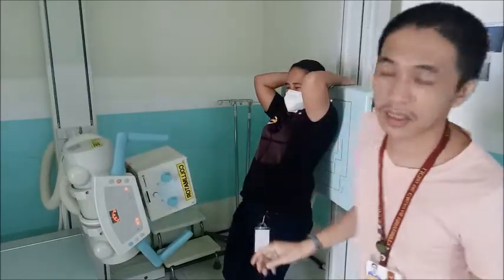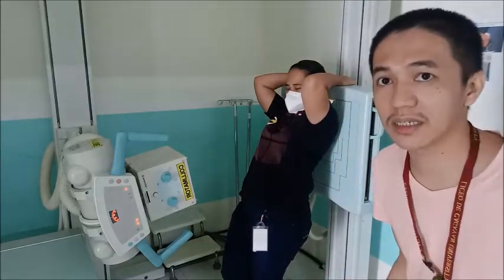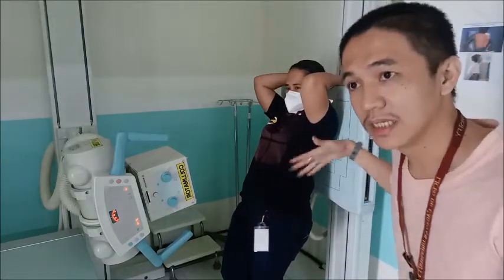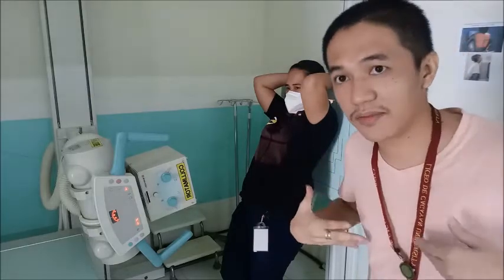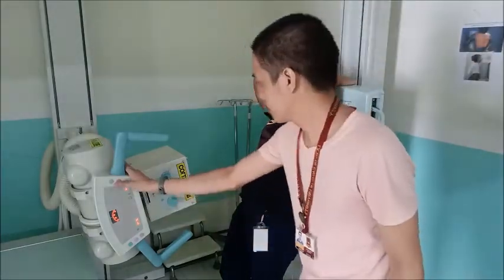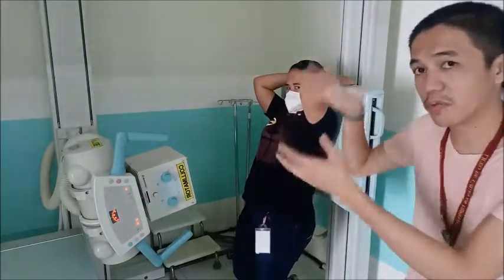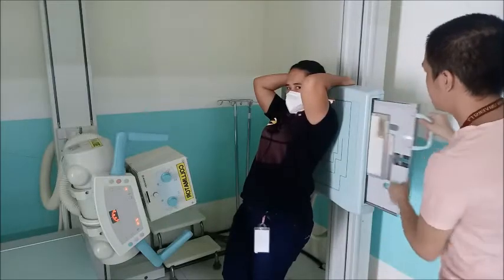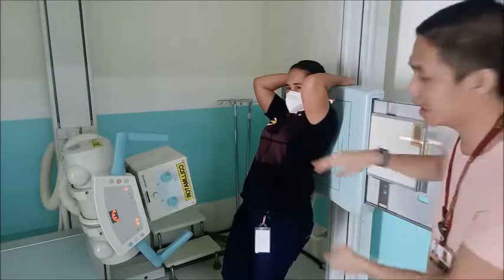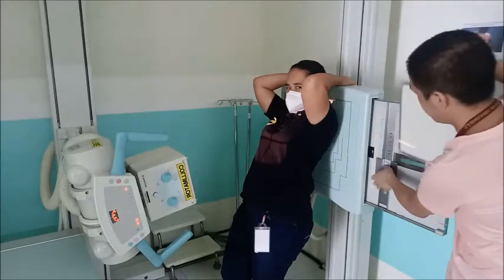So paubos yung mga X-ray tube so that the central ray should be directed same gihapon at the level of the T7 yung entrance. So kapag ganina, perpendicular itong central ray, ito yung paubos ng cassette. This time, since ato mong gi-angulate ato ang central ray, ato siya ibalik pa sa ata.